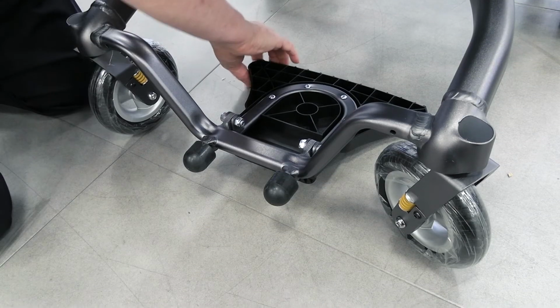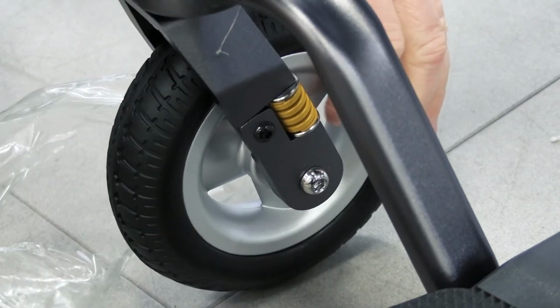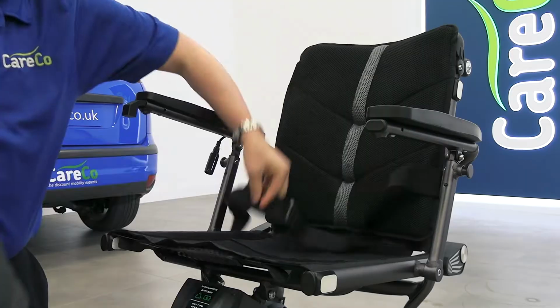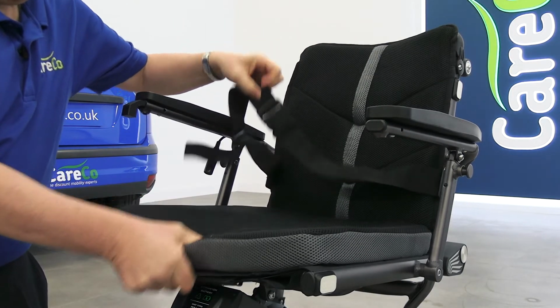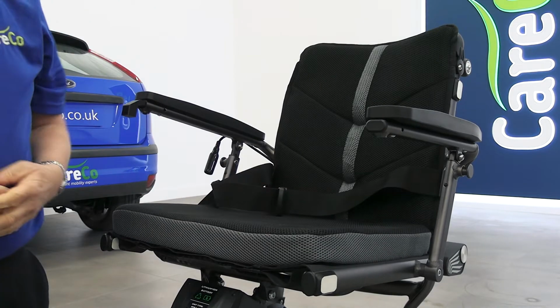Make sure the footplate is flipped out so that the user may comfortably rest their legs whilst on the move. Remove any wrapping on the caster wheels before you take the chair out. Next, press the seat cushion onto the chair frame and use the Velcro underneath to make sure it's secure.